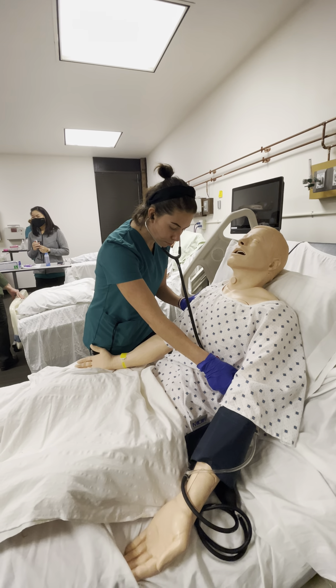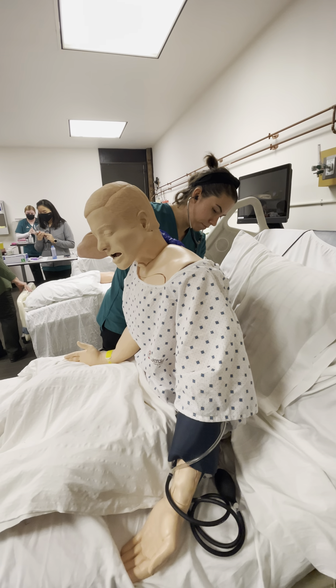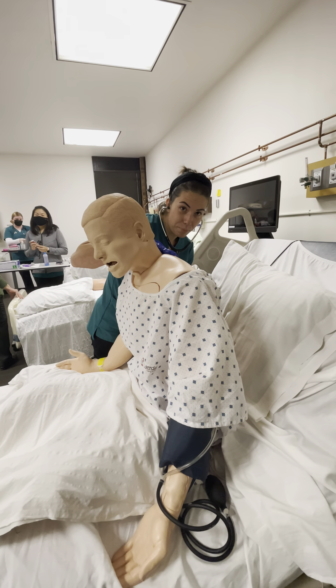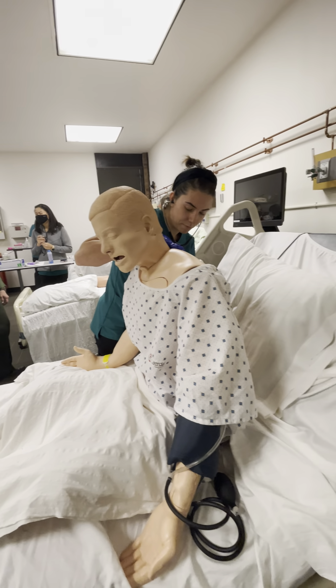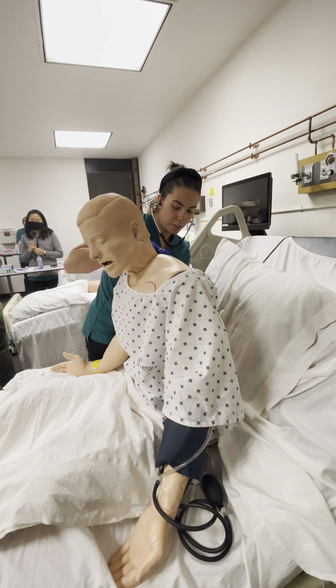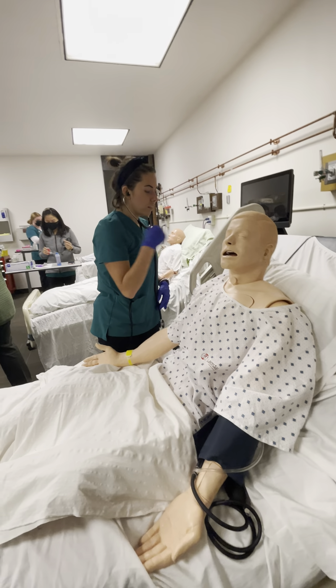Hi, my name is Ella. I'm going to be a respiratory student today. Can you please verify your name and your date of birth? Perfect. I'm going to listen to the back again — let me go ahead and do some hand hygiene. I'm here to show you how to use your hand inhaler today. Nice deep breaths. Sounding good.